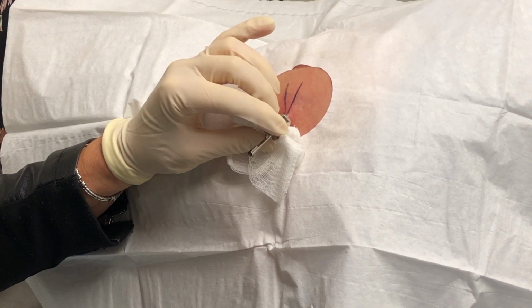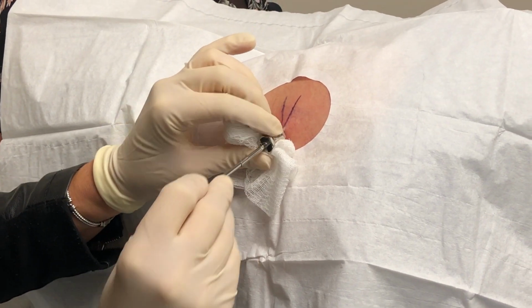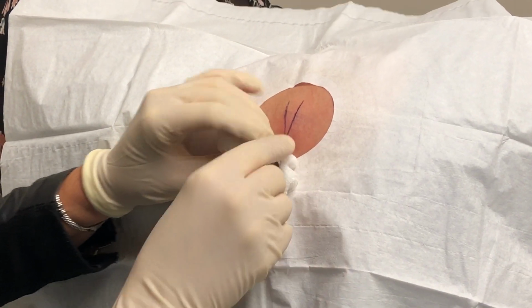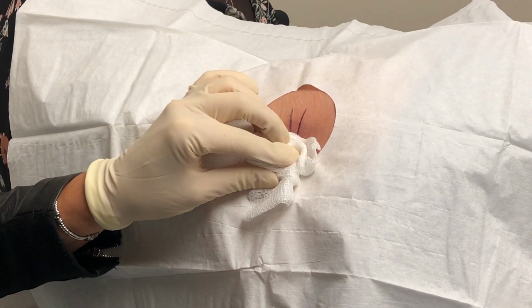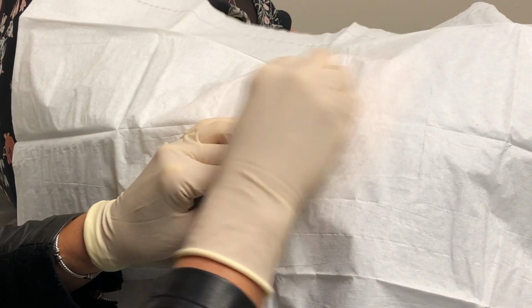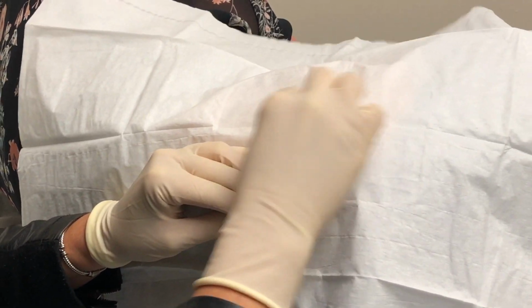And we advance it underneath the skin with a blunt end, like this. So then that pellet ends up being about 1 inch or so away from that incision. And that's about it.